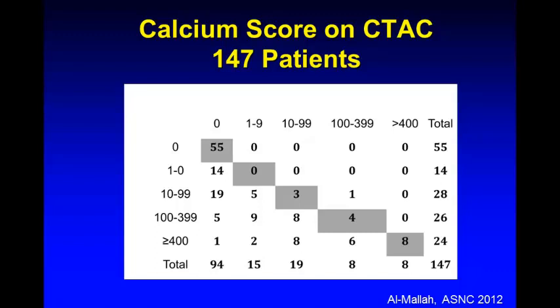And if you don't see calcium on the calcium score, then there is clearly no calcium, obviously. You're not going to see it on the attenuation correction. The problem is that out of the 94 patients that we said have no calcification on the attenuation correction, only 55 had none on the calcium score. These were obtained literally 1 second apart. So one of them is CT attenuation correction, then we did the calcium score.